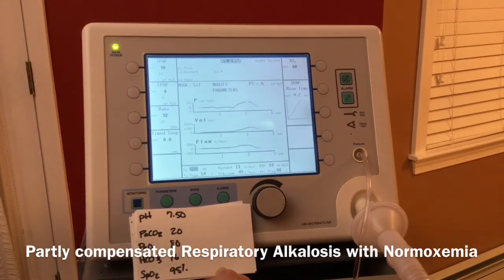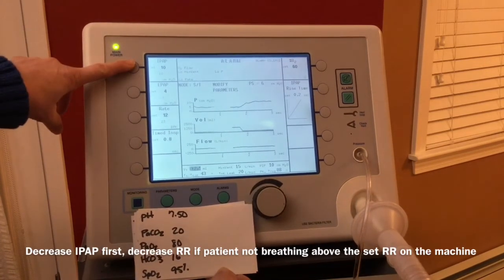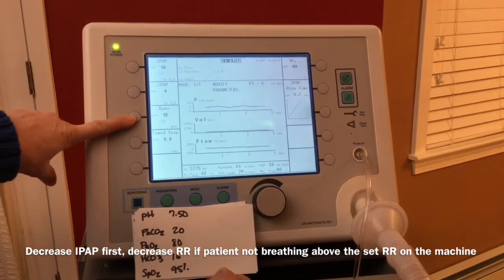Is this a ventilatory or an oxygenation problem? If you said this was a ventilation problem, you were correct. What parameters would you change to improve the ventilation defect? If you chose IPAP and respiratory rate, you were correct.